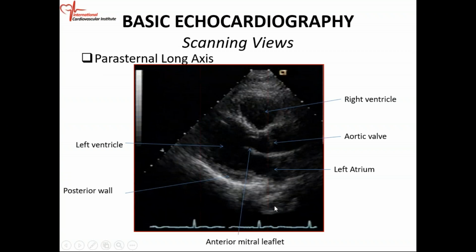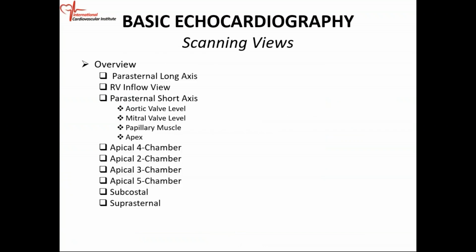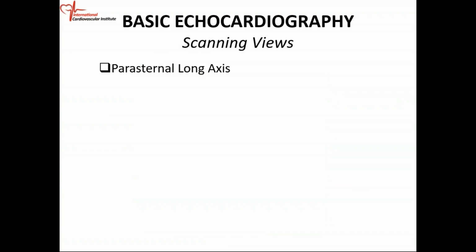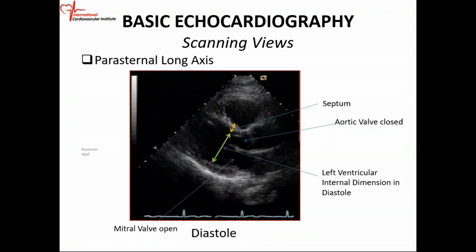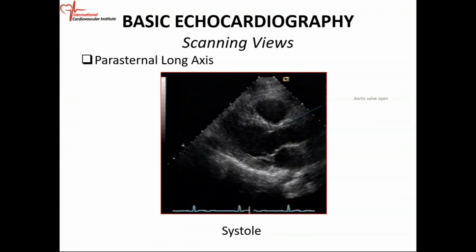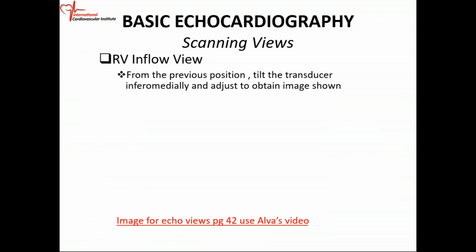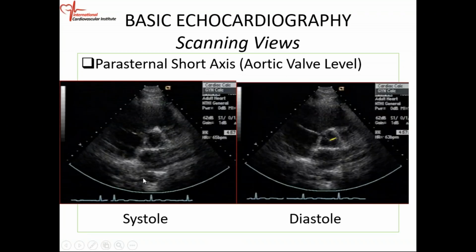And if it's enlarged, you can quickly see it. And you should measure it. If there is any question about aortic aneurysm, dilatation of the aorta, and you can see it and measure it, you should measure it. Okay. But in the short axis view, this is your descending aorta right down there. So descending aorta. Okay.